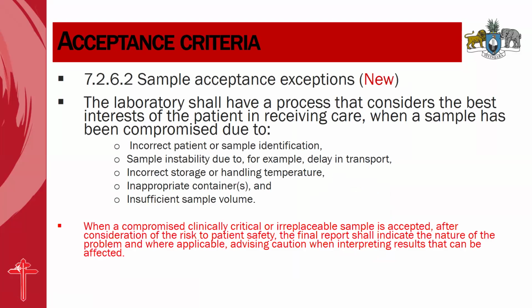Then the acceptance criteria, according to 7.2.6.2 of the ISO 15189:2022 standard.